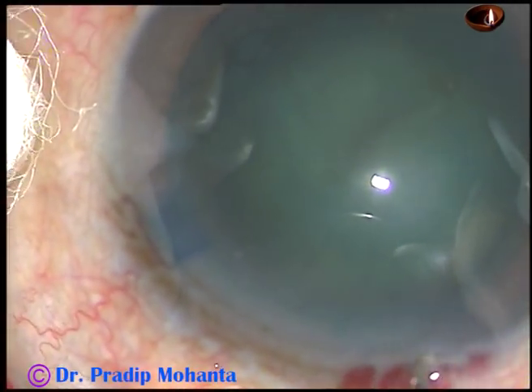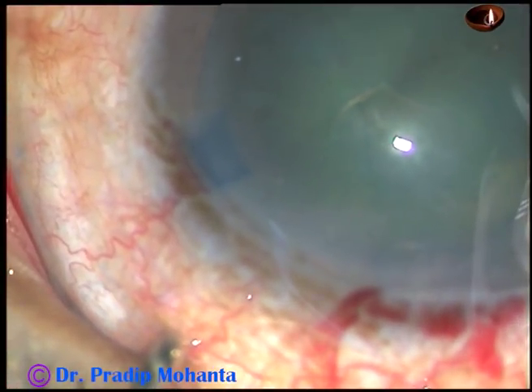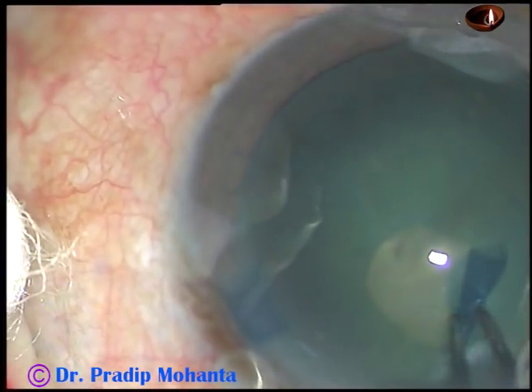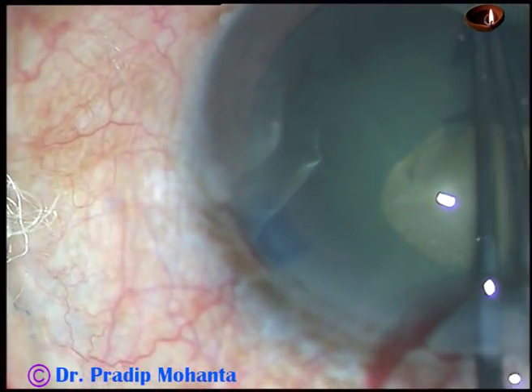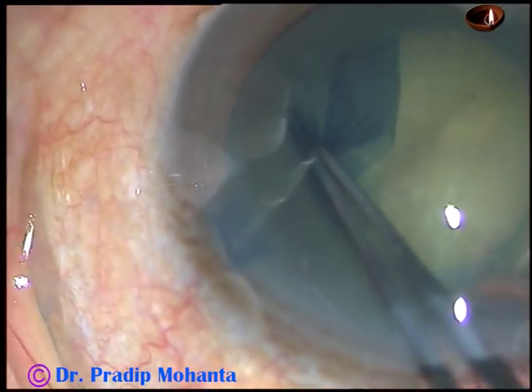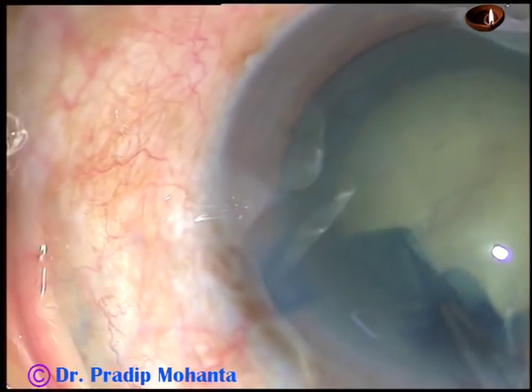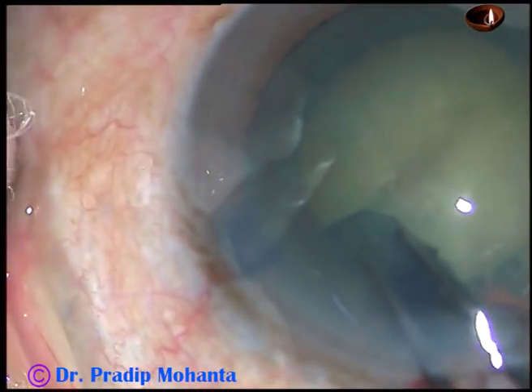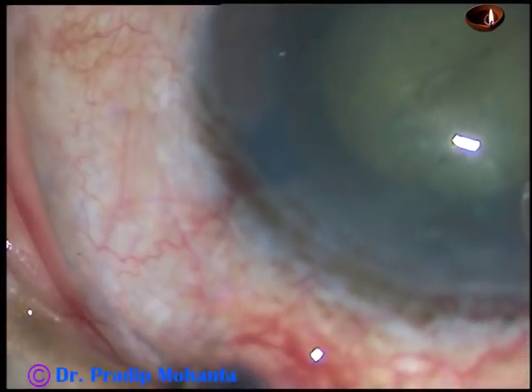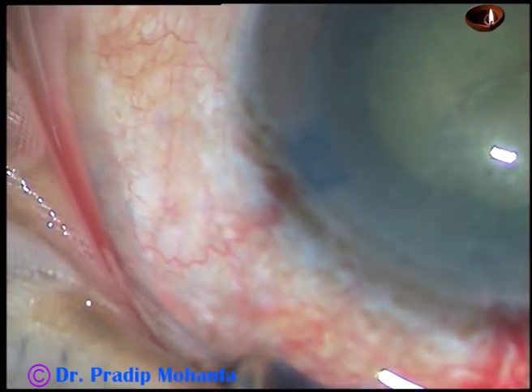And now I take a 26 gauge bent needle, introduce it through the main port, cut the anterior capsule, and make a capsular tag. I hold this tag with a utrata forceps, using the anterior lip of the main incision as a fulcrum — the utrata is keeping an upward thrust always on the anterior lip, moving all around, thus preventing leakage of viscoelastic substance from the anterior chamber. If you do it this way, you can easily use a utrata forceps. In this case, the rhexis has been good.